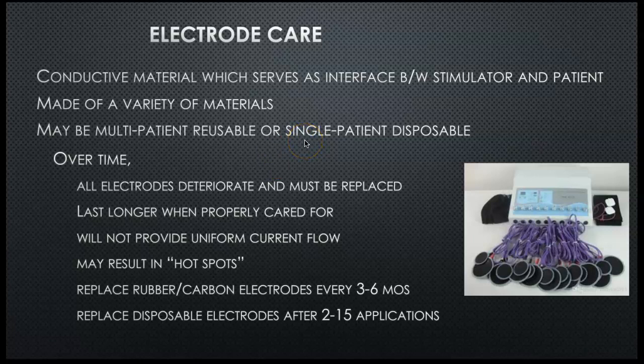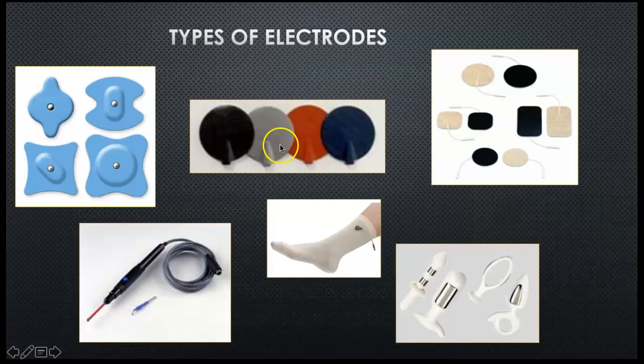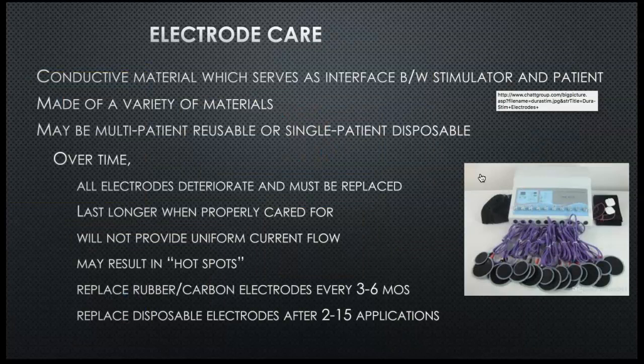Those are the kinds that you have, but they also might be reusable and be able to use on multiple patients, such as the carbon ones. Let me go back one slide. These carbon ones are able to be reused on lots of different people and cleaned, versus these, which you should only use on one person, and once you use them a few times, you throw them away. Over time, all of them are going to deteriorate and must be replaced.